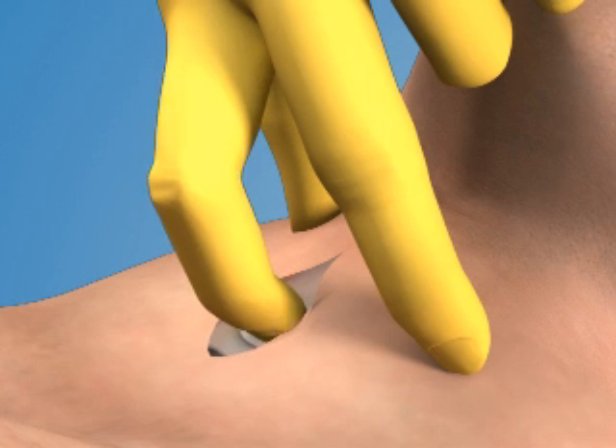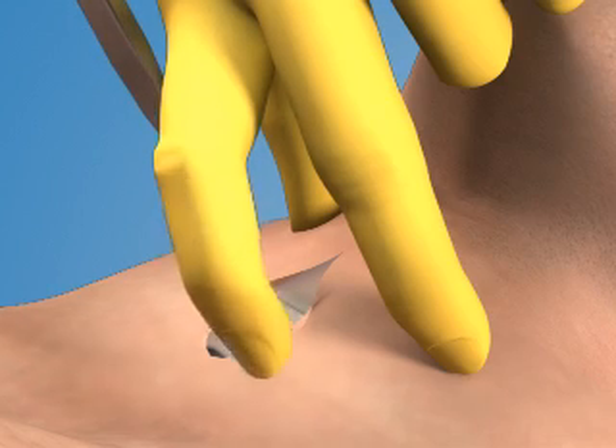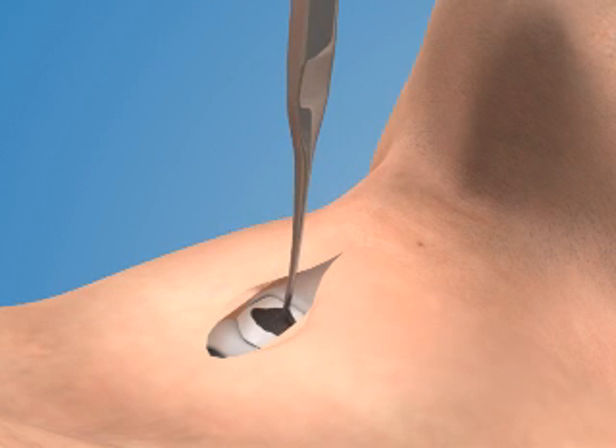Temporarily place your index finger into the stoma to maintain a firm fix on its location. Next, place the tracheal hook into the opening in the membrane. Rotate the hook cephalad and pull it gently toward the ceiling to snare the inferior aspect of the thyroid cartilage.